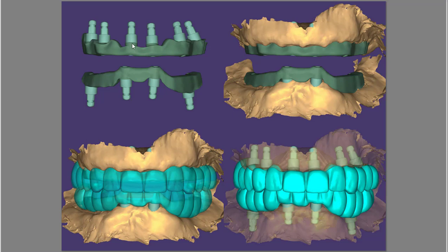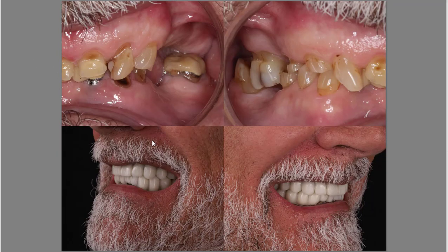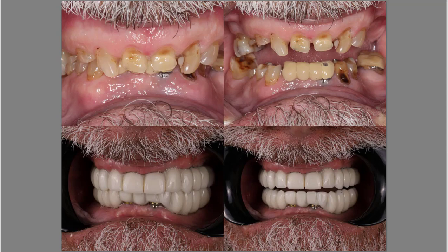You can appreciate the depth of the multi-unit abutments inside the tissue on the upper arch compared to the lower arch. You get much better tissue adaptation for FP1 when the multi-unit abutments are sub-crestal, and not as great if they're supra-crestal. Even opening his bite, we had some challenges, but we're able to stay FP1 for both upper and lower and open his bite 8 millimeters on top. You can see a little bit of the multi-unit abutment platform showing here.